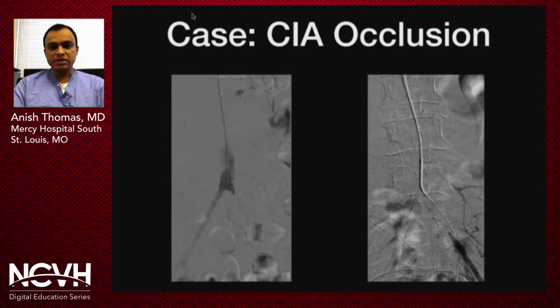However, with this dense calcified occlusion, I was clearly subintimal at the reconstitution point. In cases like this, you have the option of trying either a CART or reverse CART or a SAFARI technique. However, given how far subintimal I was, I decided not to try this antegrade, but to use my retrograde access.